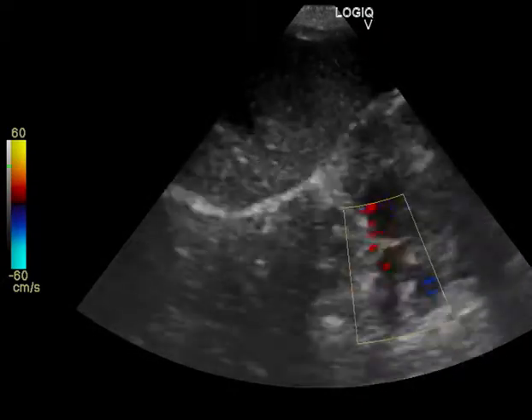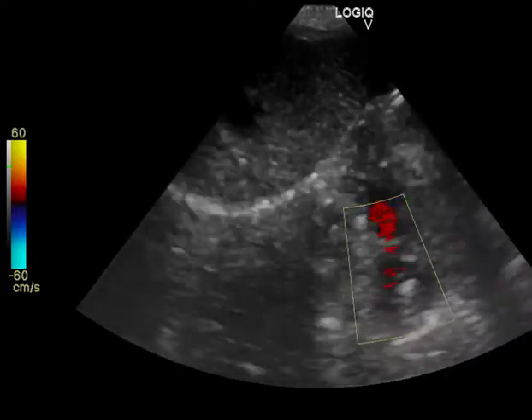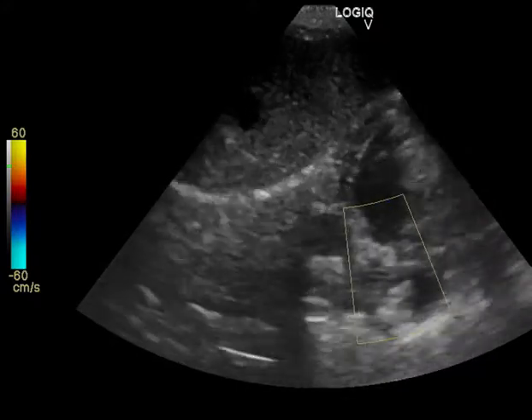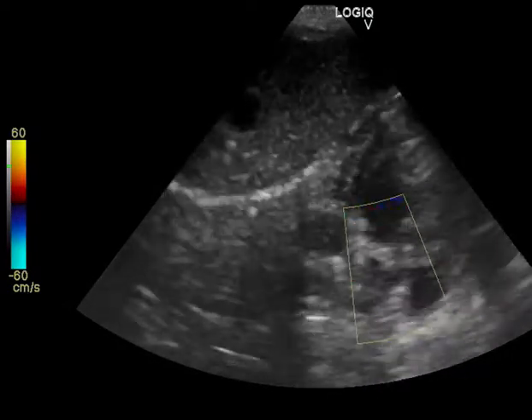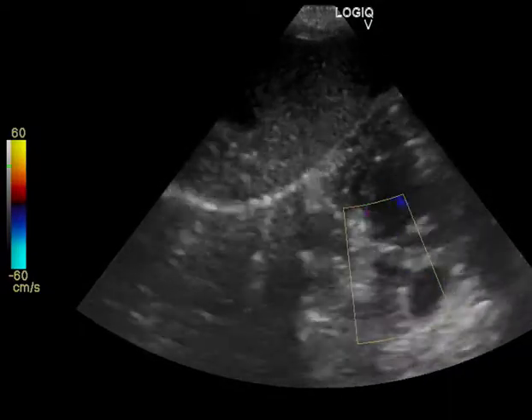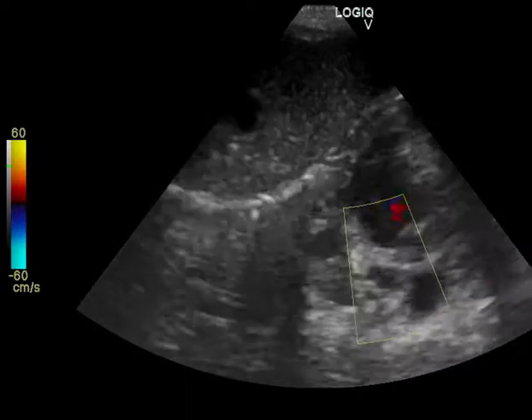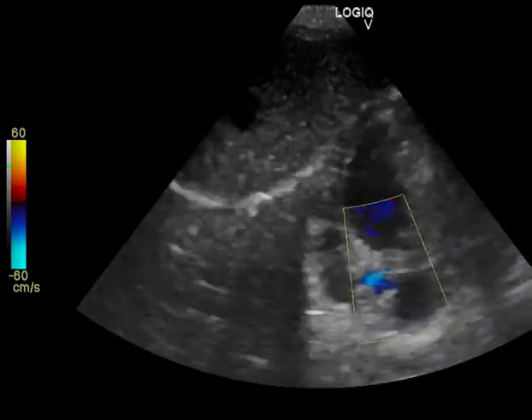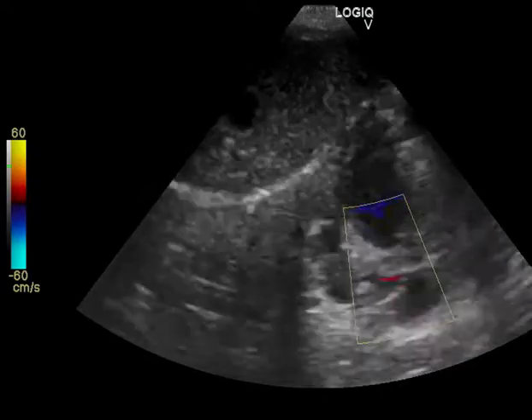Then go through your progression: LVM M-mode, EPSS, LA max, LA/AO. Center the LA/AO, turn to short axis, run the short axis sweep from Mercedes to fish lips to mushroom and back. Come back to the mitral valve in the bottom right of the screen — go back to your brick, then bring the tail of the probe caudally a little bit. Go to position two, point to the right shoulder, get the tricuspid valve and pulmonary artery, go to position three, then position four and center that aorta nice and clean. Then go back and do the same progression again, adding color flow, then spectral, then PW spectral, then CW spectral as a progression. Once you get that progression down and it becomes like breathing, every presentation you run into will be the same. Excellent start — you're on the right road.